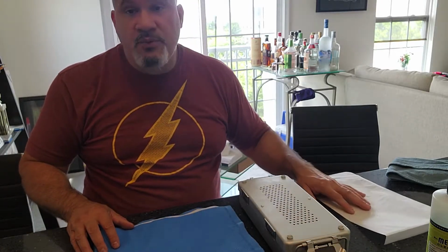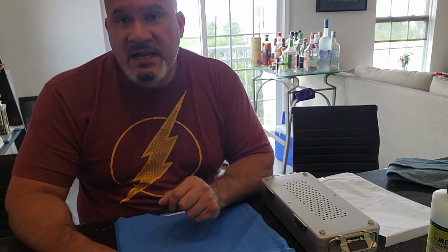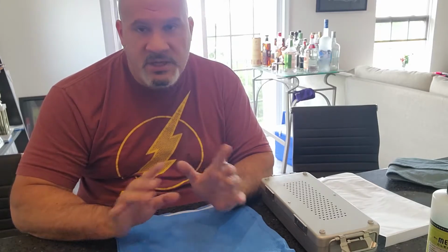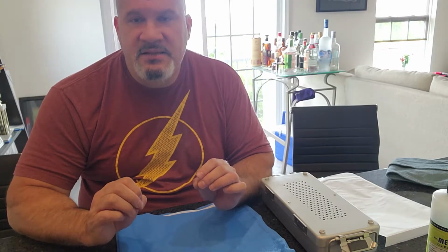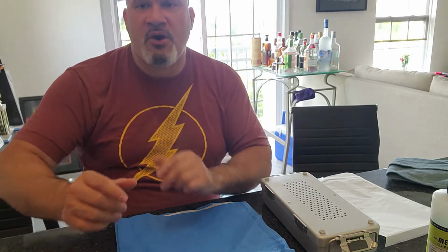The second thing you want to look at is your medical device. What modality of sterilization is your medical device validated for? We're going to speak steam now. If it's validated for steam, first you want to see what temperatures it's validated for. A lot of IFUs speak specifically about whether products are validated as being wrapped or unwrapped, and that threw me off so much in my career, guys.